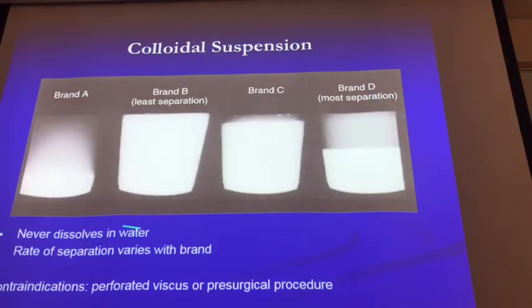Barium never really dissolves in water. Remember that. It doesn't dissolve. You just mix it with water. That's why it's called a suspension, because it's only suspended in water. If you leave it there 4 hours or days, eventually this will happen. The rate of separation varies with the brand. Contraindications: perforated viscus. This means perforated bowel or pre-surgical procedure. These are going to be the contraindications.